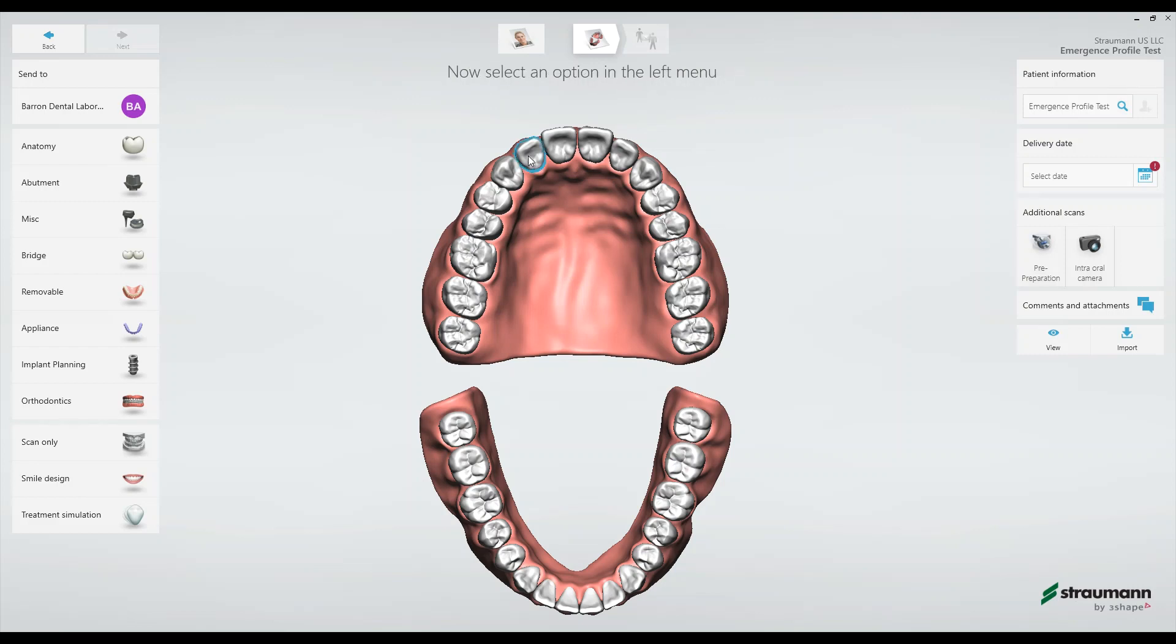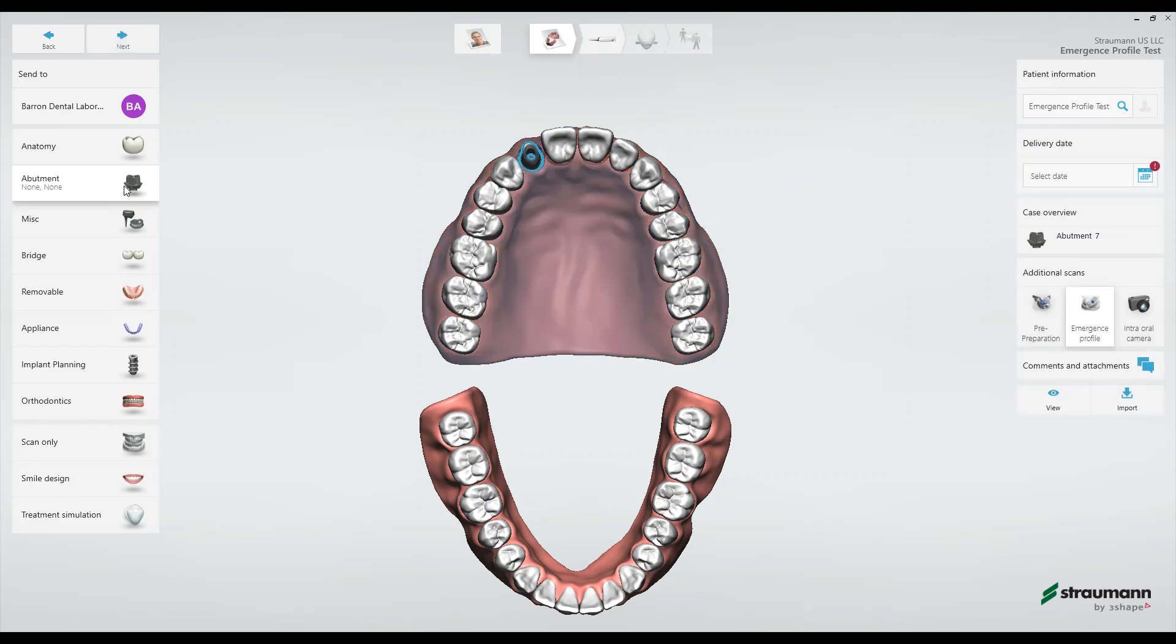So the case we'll be looking at today is a Strauman RC implant scan in tooth number 7. We'll begin with setting up the work order right here in this page. First I'll select tooth number 7 then I'll come over here to abutment. Then I'll select the type of crown. I want this to be a screw retained crown.